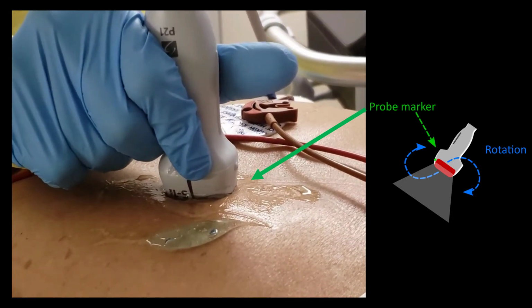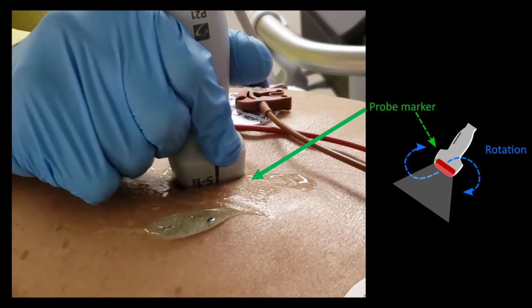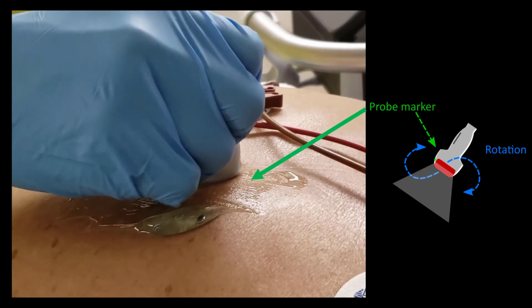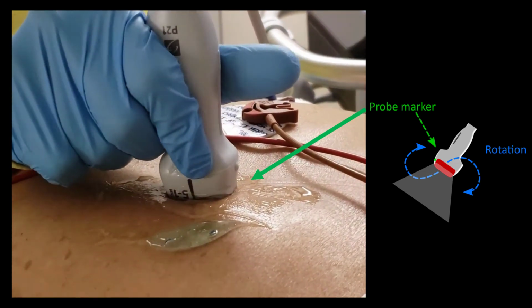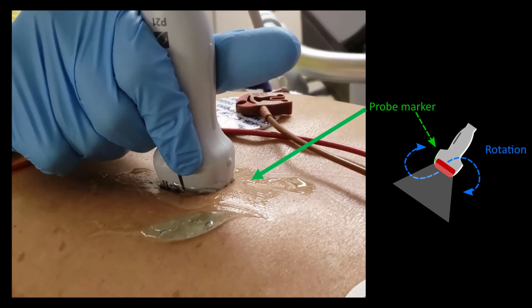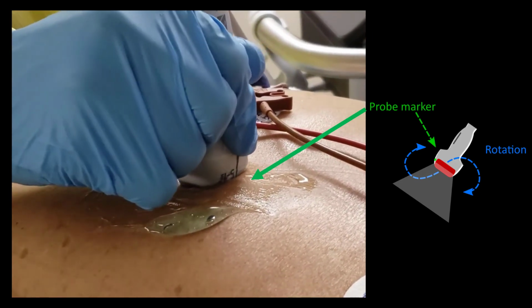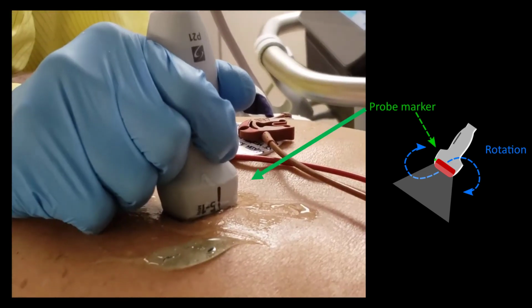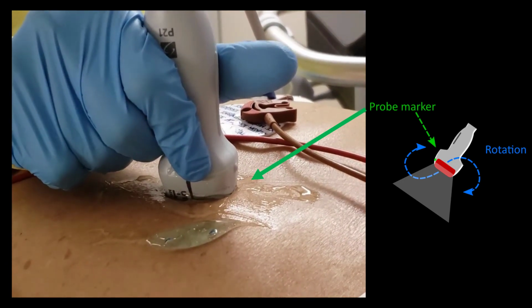Rotation has different effects depending on where you are in the body. Overall, though, two main rules emerge. First, it makes things that are long round, and things that are round long. As an example, vessels seen in their long axis will become cross-sectional with a rotational movement. Second, it helps align structures. A good example is being able to see the whole vessel in the longitudinal axis rather than having part of it disappear. Another good example is aligning the mitral valve and aortic valve to be both visible in a parasternal long axis view.